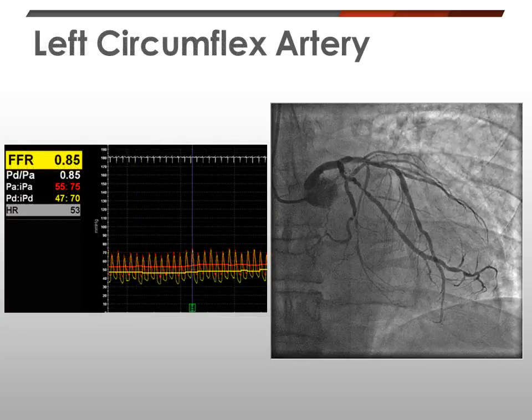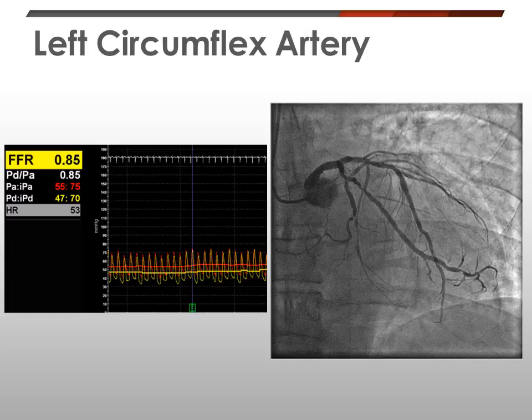Then the left coronary artery was intubated. The same pressure wire was guided towards the obtuse marginal 1 branch and parked in the distal part of that branch. Again IV adenosine was started and the FFR recorded was 0.85, which is again insignificant. The stenosis present in the proximal circumflex as well as in the proximal segment of the obtuse marginal 1 branch is hemodynamically insignificant.